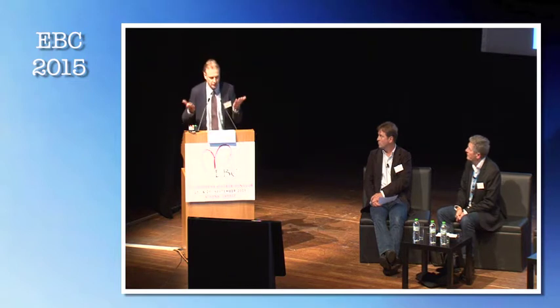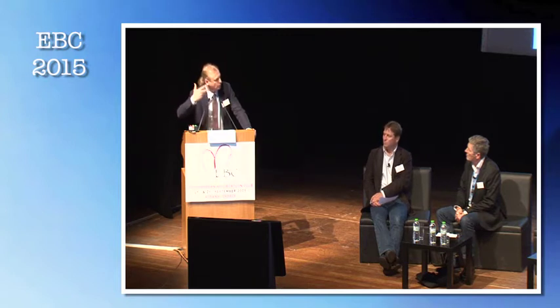Thierry, we have only 50 patients. I don't know exactly. That's what I showed, and maybe it will create new ideas on how and what to do. But this is how we did it. Then again, we have different techniques in these 50 patients. For example, we have some two Culotte techniques, only because we couldn't go through the struts.